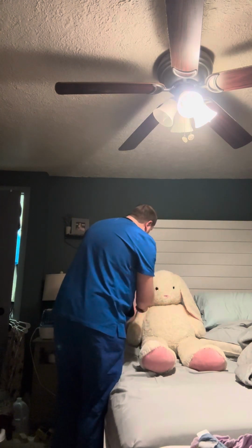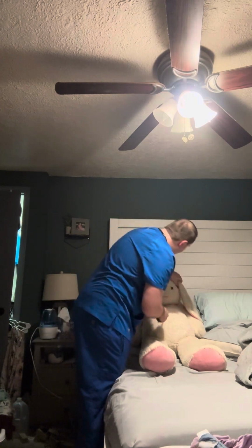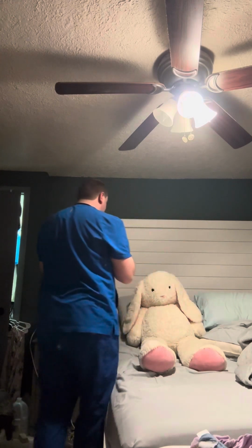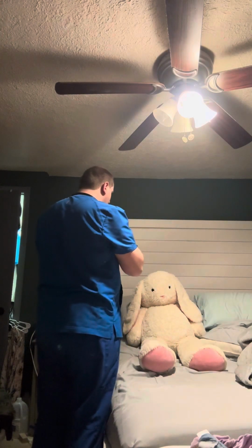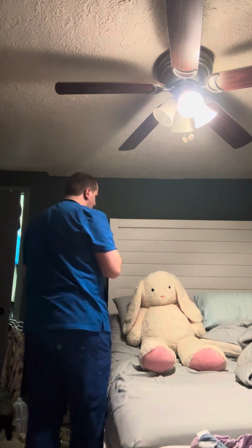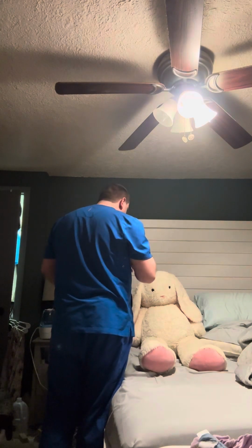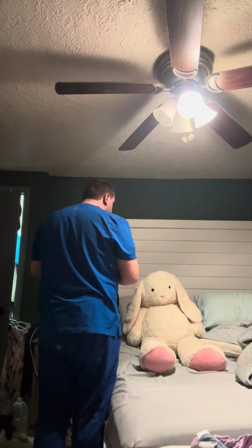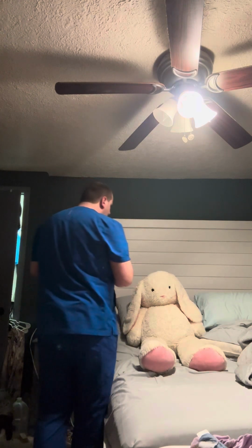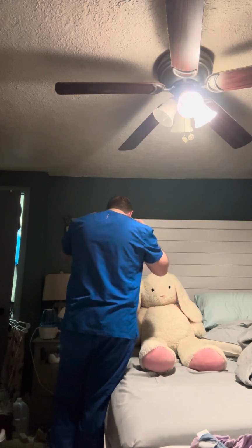I would also take a look at the patient's ears using an otoscope, ensuring that there doesn't appear to be any fluid behind the eardrums. I would then listen to the patient's lungs. I would have the patient lean forward. So I'm just going to have you lean forward here and take a couple of deep breaths for me.